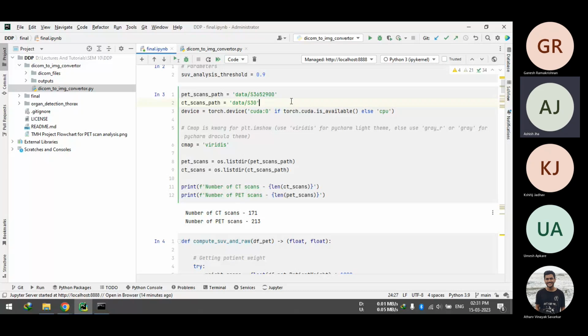And then we can contour again, and our accuracy might be, say, 70%. So we can just exclude the 30%. Wherever we are correct, we can take that for training purposes. Likewise, I believe we can solve that problem.